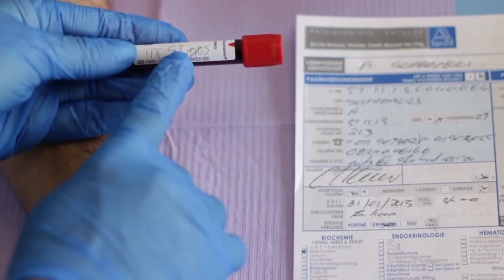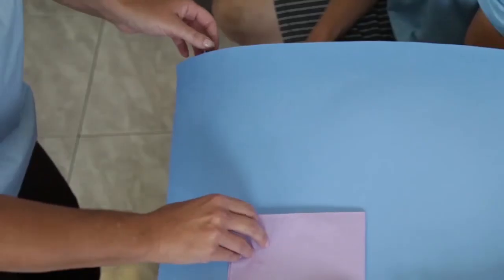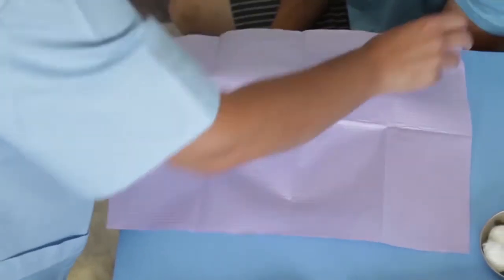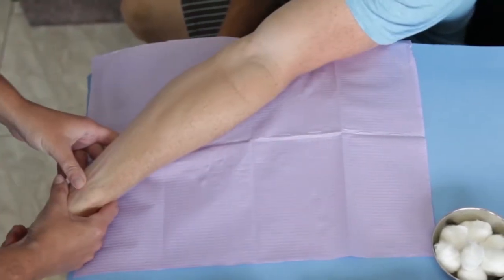Check labels and forms for accuracy. Perform hand hygiene. View a clinical example of this procedure. You may notice slight differences in the procedural steps due to individual preference or variation in protocol.